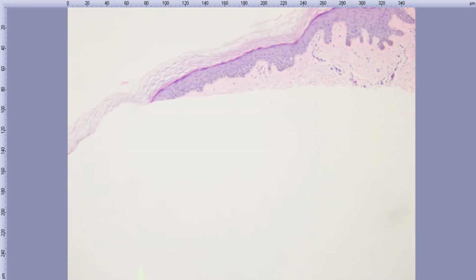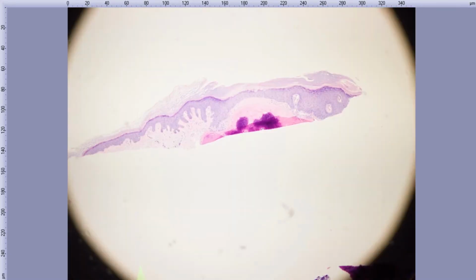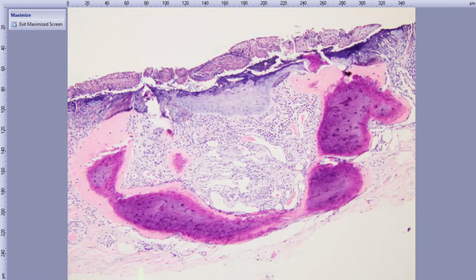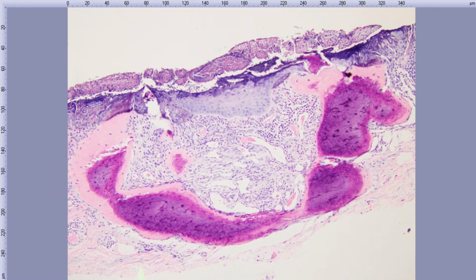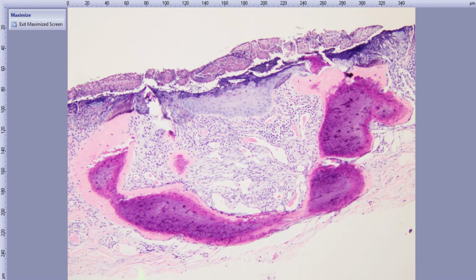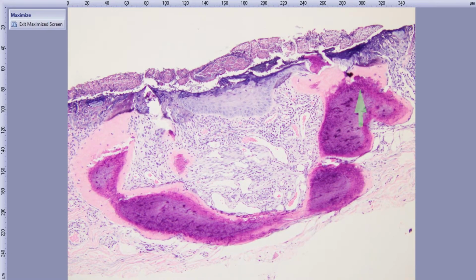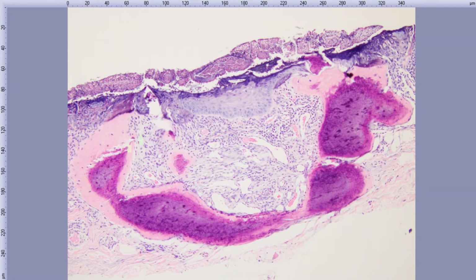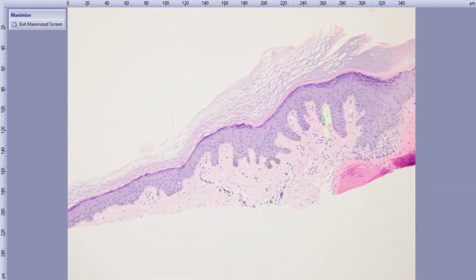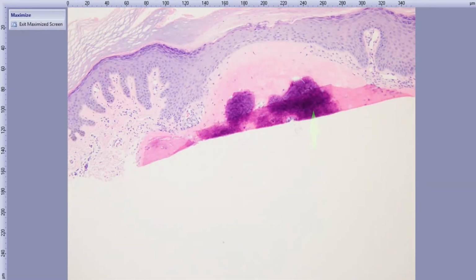All right. What do you guys think about this? We've got typed in from 2 places there, osteoma cutis, which is exactly correct. And the main thing, this is all purple, so this is sort of calcified bone. This orange, eosinophilic periphery is really the heart of the bone tissue. So that's a classic picture of that. And right here, even more so, the orange has kind of taken over.